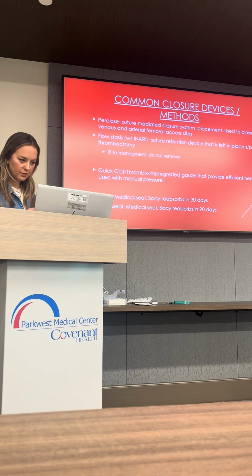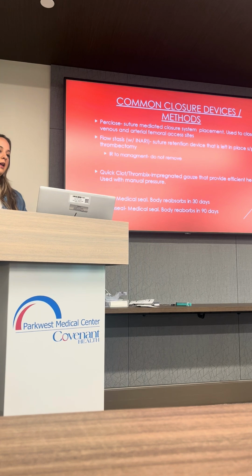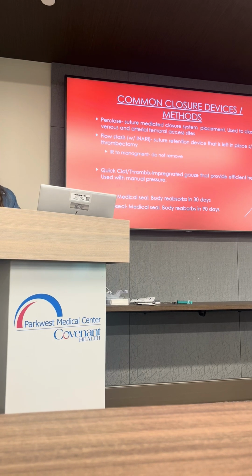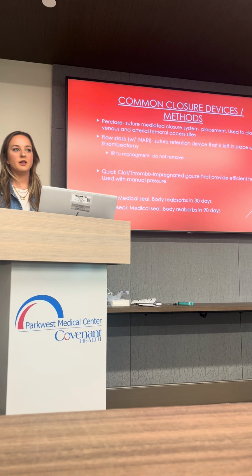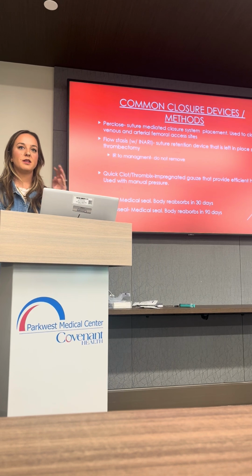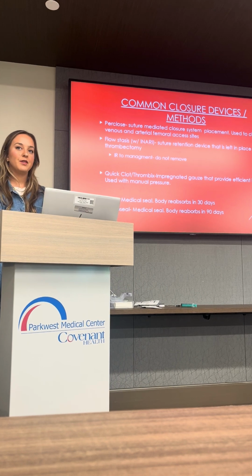Now, PerClose is something that you often hear that we use pretty often in our patients, and it's just a suture-mediated closure system. You don't necessarily need to know much more about it other than, you'll see these oftentimes with Impellas and Impella removal. There's often a box that is taped to the Impella that's labeled PerClose, and it's got all the tools and everything needed for those. You don't have to do anything with it.